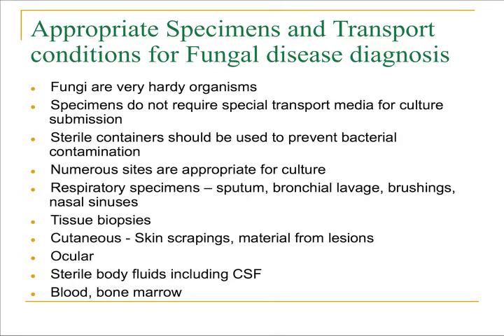You just have to make sure that you're eliminating bacterial contaminants, because bacteria grow faster than the yeast or molds and can overgrow these organisms and perhaps eliminate them from a culture. You can submit respiratory specimens, tissue biopsies, cutaneous biopsies and specimens, ocular, sterile body fluids, blood, and bone marrow. All of these are capable of growing fungal organisms.